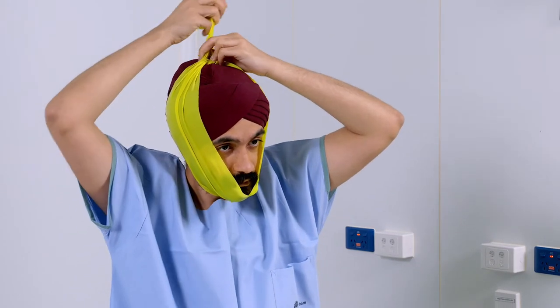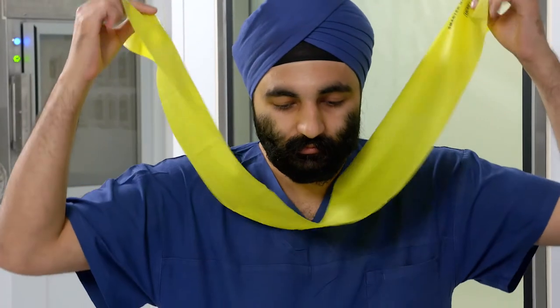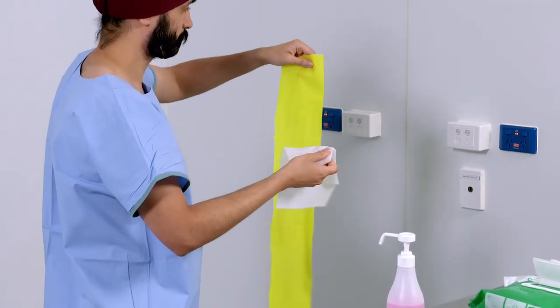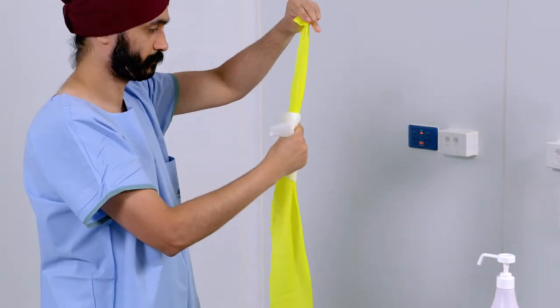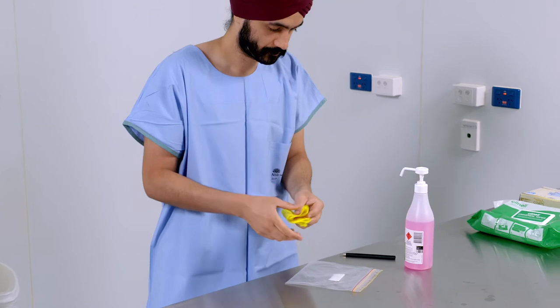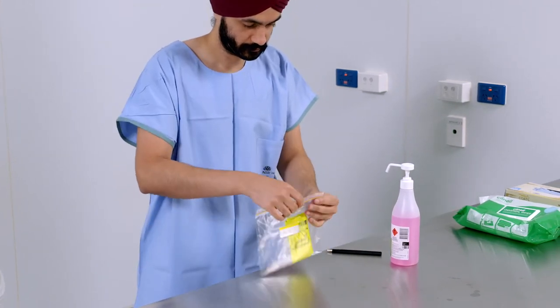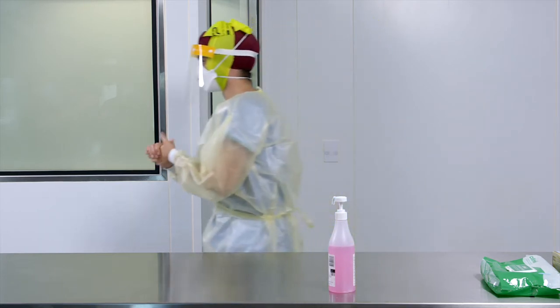Once a suitable band has been selected and a fit test has been passed, the same band width, length and type should be used whenever a respirator is required. Elastic bands can be cleaned, disinfected and reused by the same person. The bands can be considered for extended or sessional use. The rest of the personal protective equipment must be used based on the clinical care being provided.